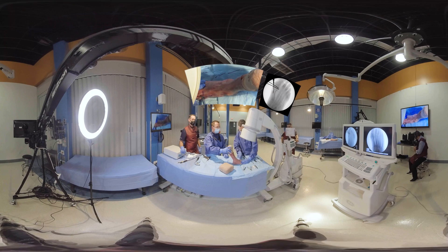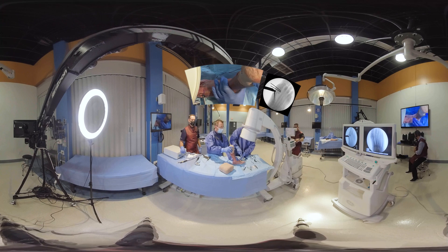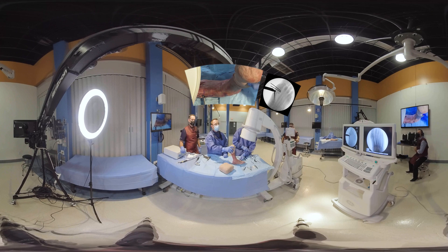You enter in with the implant, kind of side-to-side rocking it as you insert it. Dr. Campbell mentioned we need to make sure it's straight — that's a little bit too angled, I'm going to straighten that out a little bit. You see that it's more central down the shaft. What we're going to do is use the mallet to tamp it in just a little bit deeper. It has to be at the neck of the implant at the level of the osteotomy.